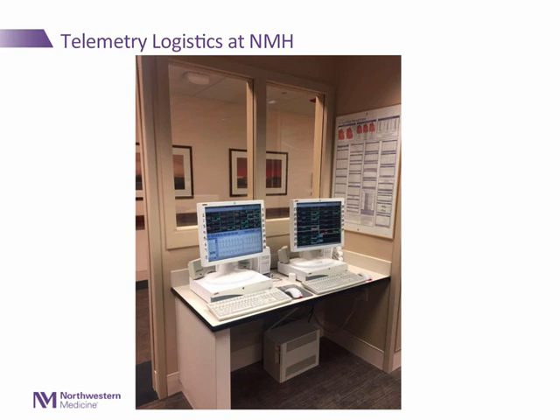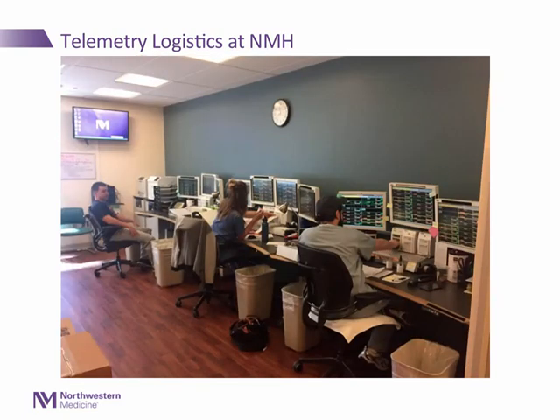The monitor may also alarm and start logging clinical events based on heart rate parameters, either high or low, which are set by the nurse depending on the patient's particular clinical situation. In addition to the automatic alarms that sound on the floor, all patients not in an ICU are also monitored in a central telemetry area located on Feinberg 15.